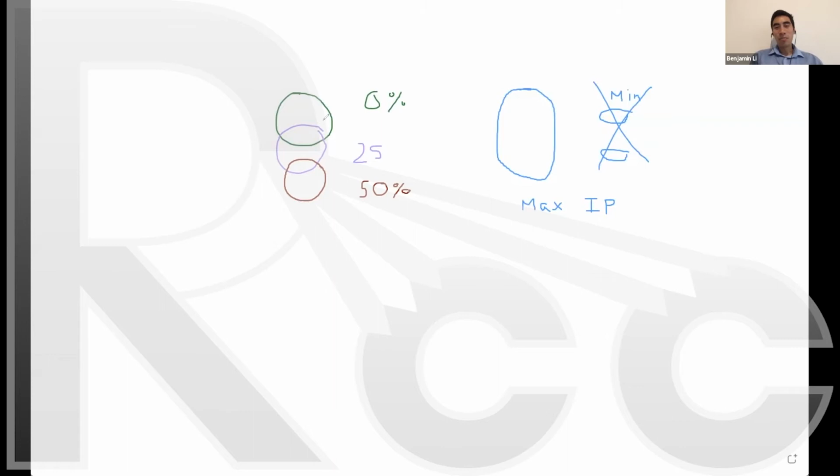And then the mean intensity projection considers how long the tumor is in each position. Because the max isn't considering the time, but the mean is considering the time. So we know we spend more time with expiration than we do with inspiration. You can see when you breathe. So the mean is going to be weighted more towards expiration when the tumor is higher.